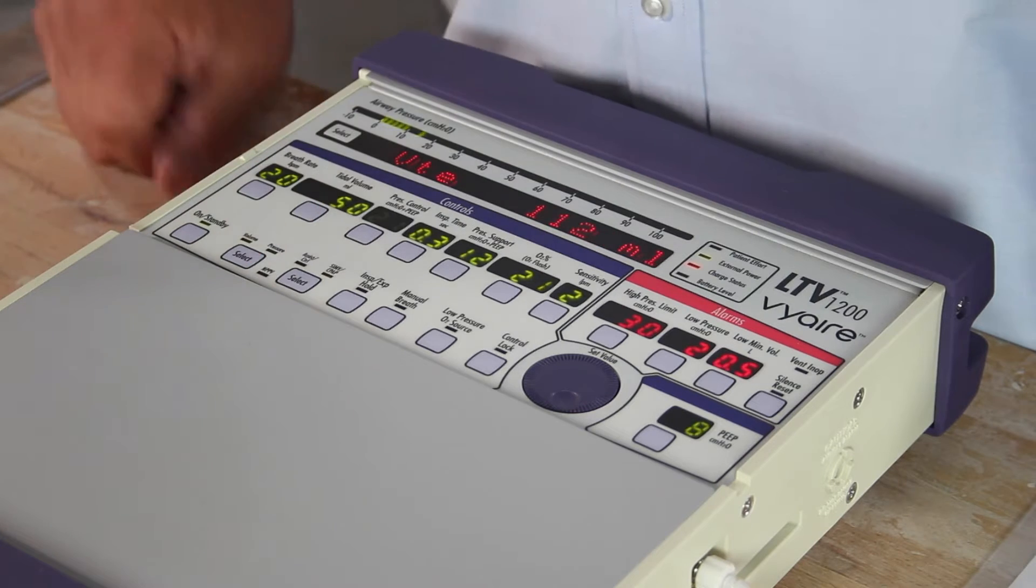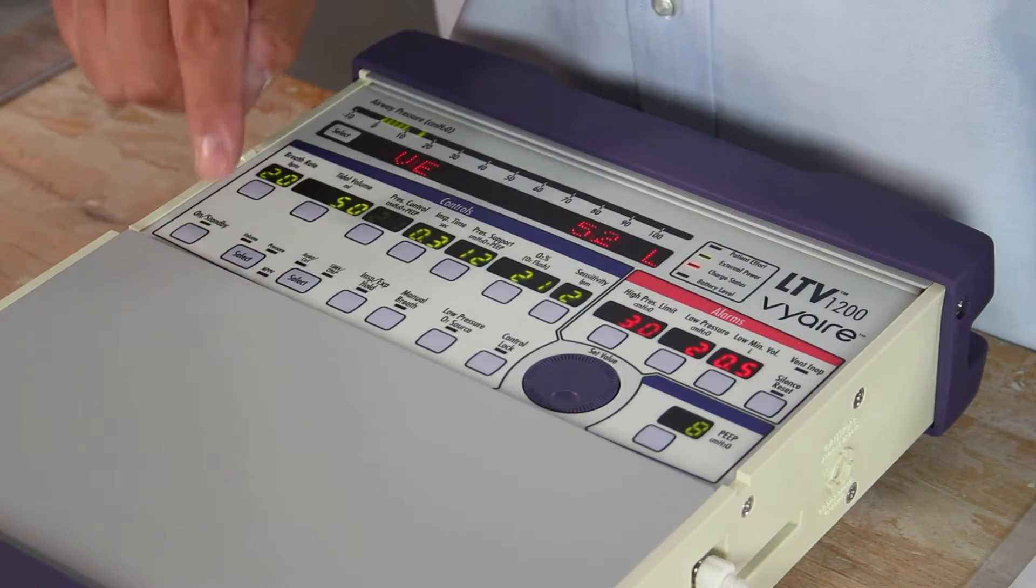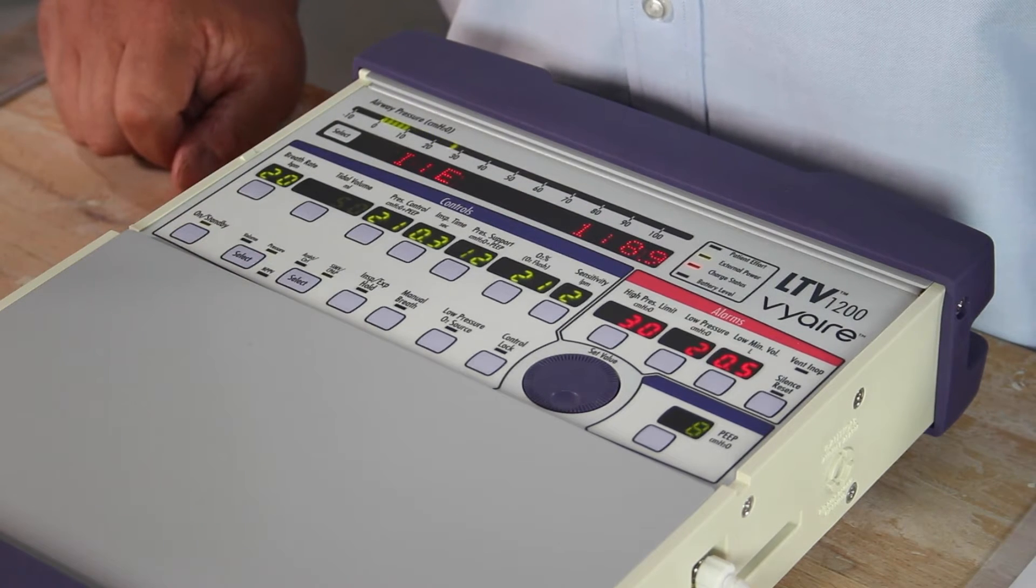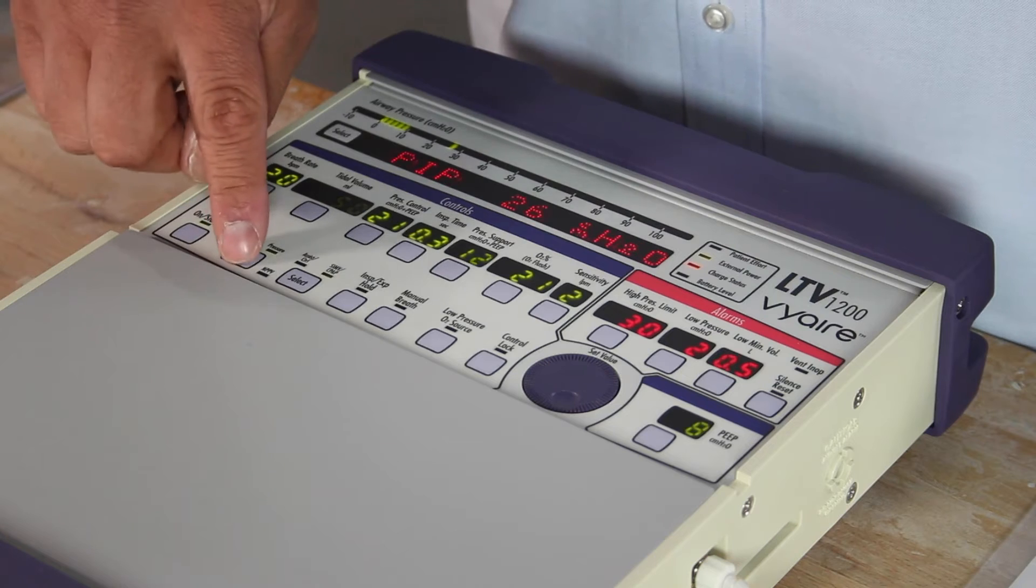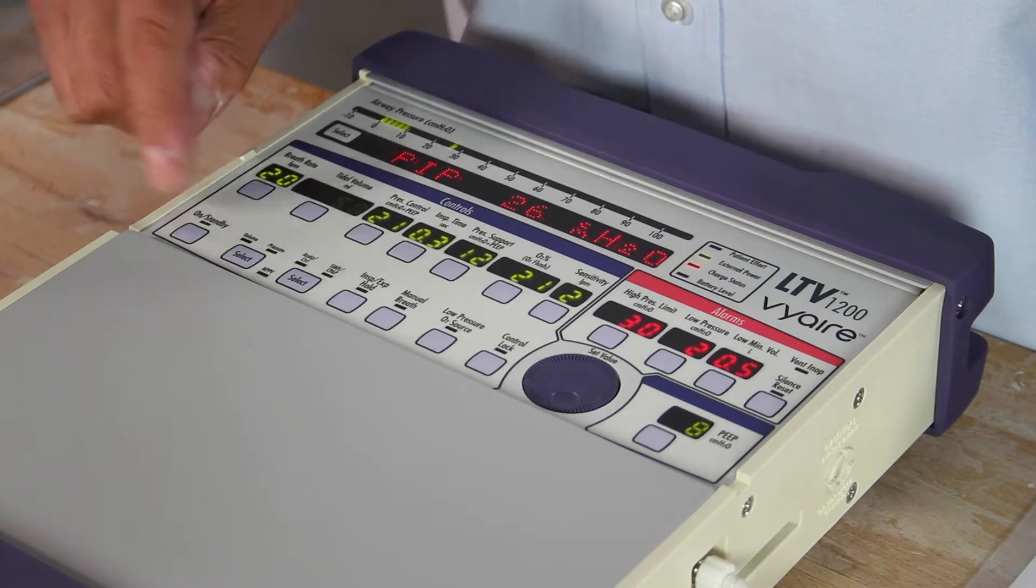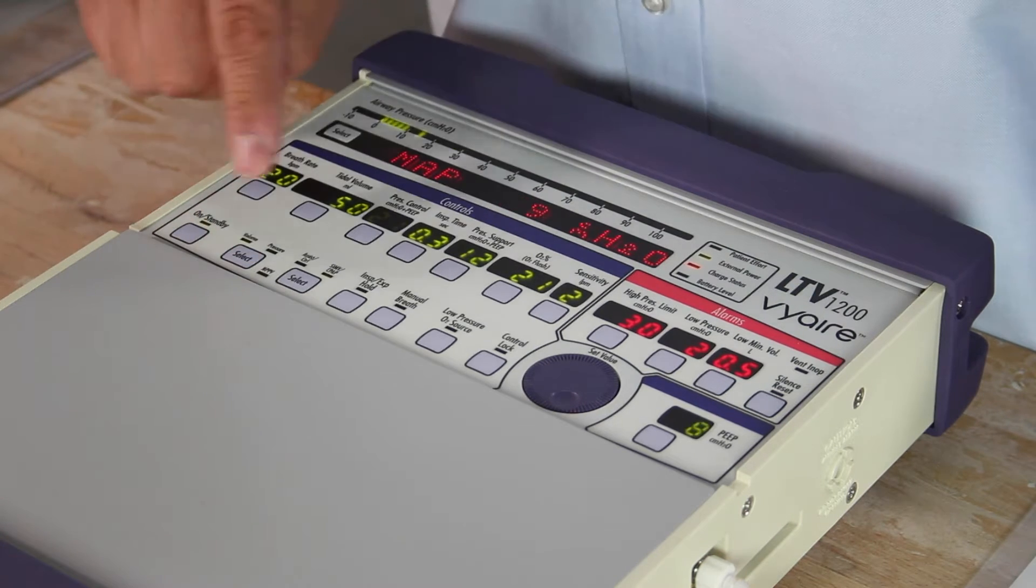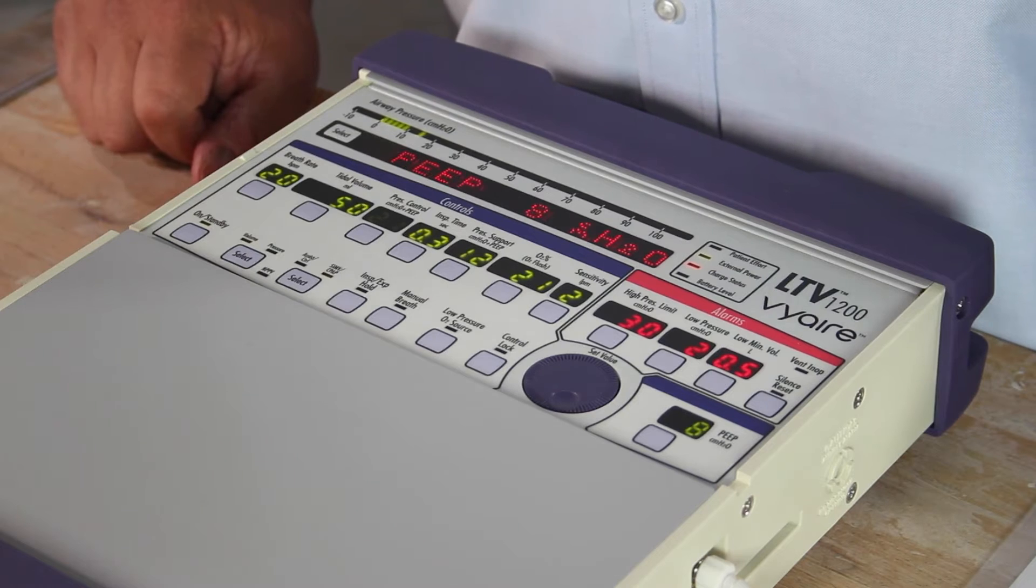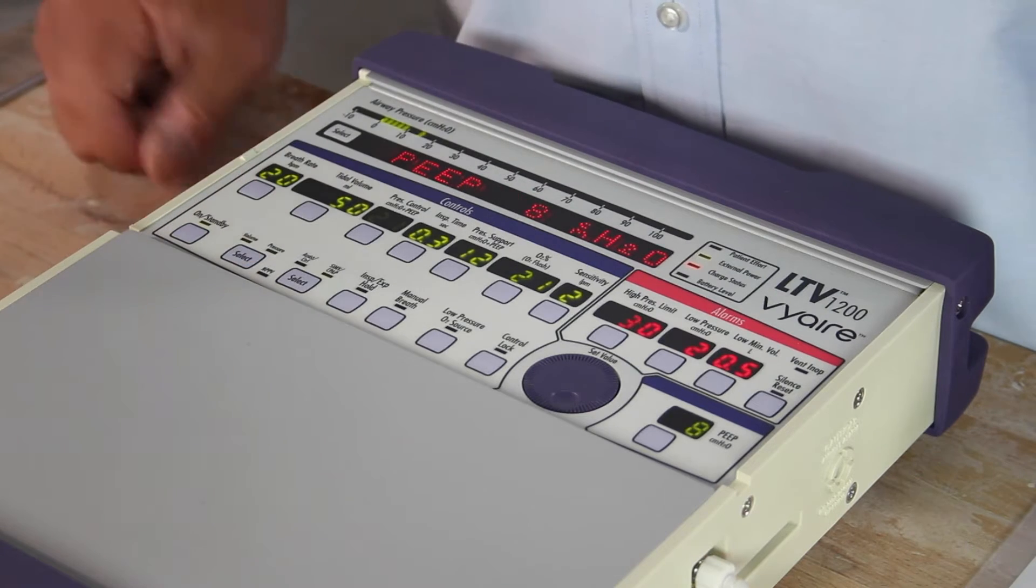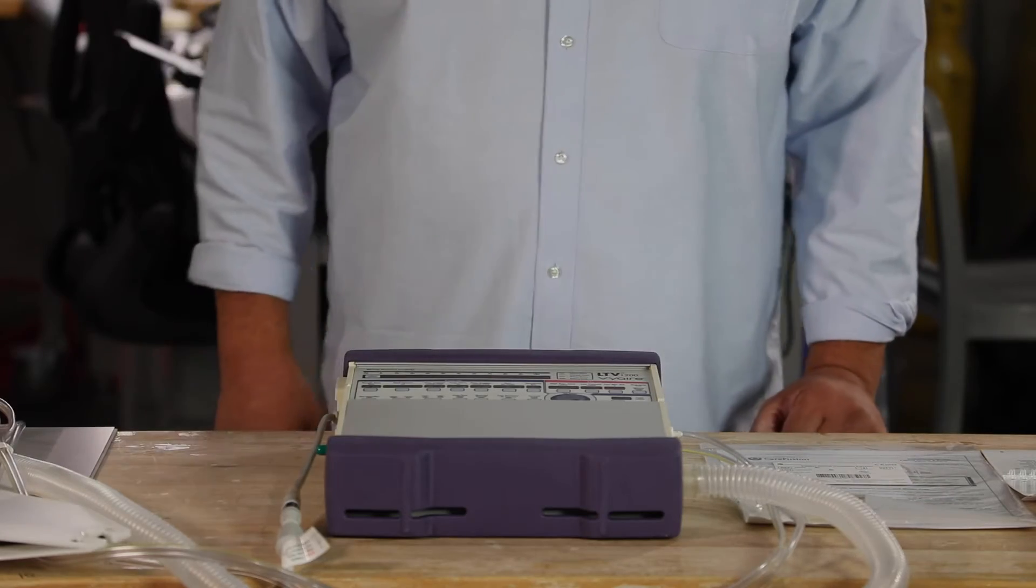Press again, pressure is blinking. I press one more time and we are back in pressure control. Press once, press again to confirm, I am now in volume ventilation. Switch back to pressure, press once, confirm, I am now back in pressure control.